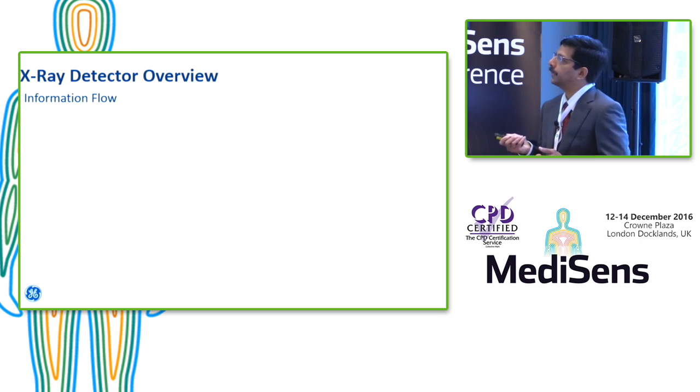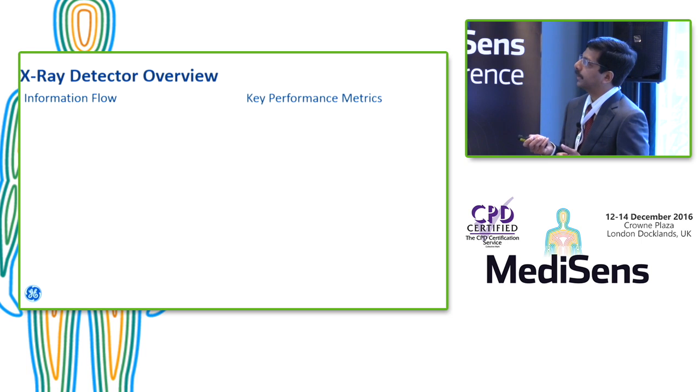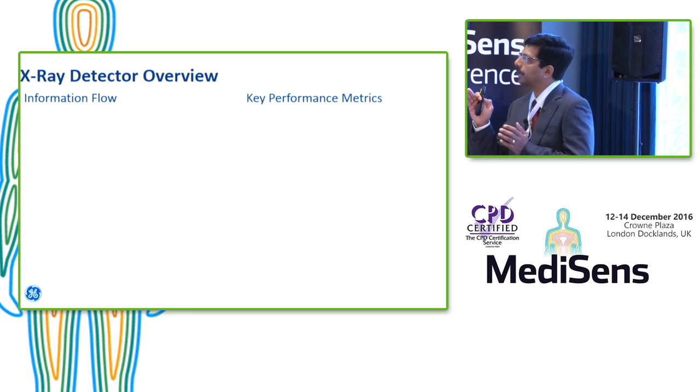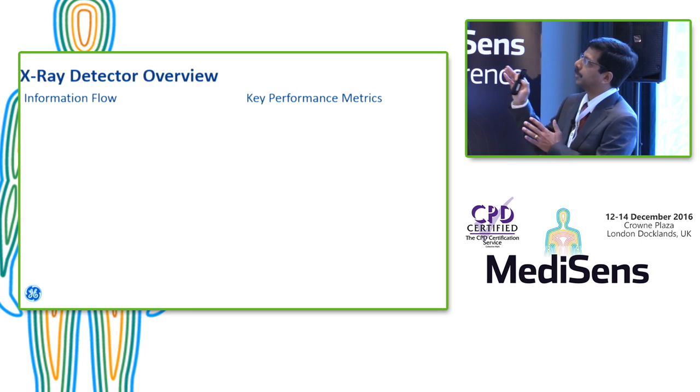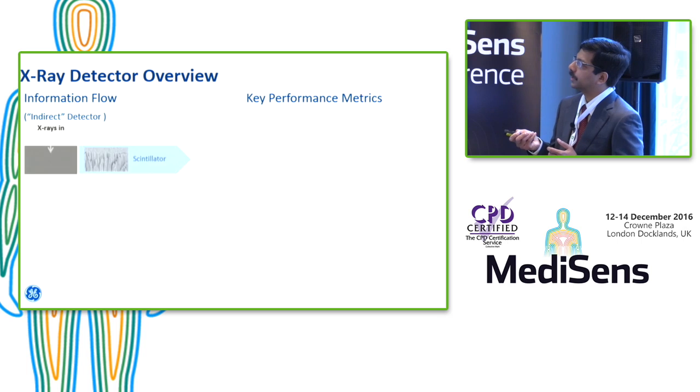Now, again, detectors come in different flavors. We heard it yesterday. Essentially, there are direct and indirect conversion detectors. I focus on the indirect conversion because that's the main detector type. I try to give the information flow perspective and also the performance metric. And for the indirect detector, let me just quickly go through it.